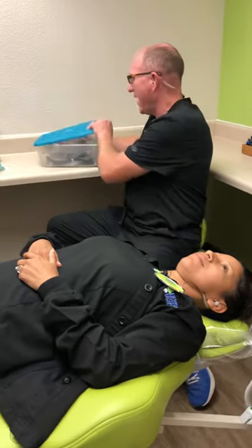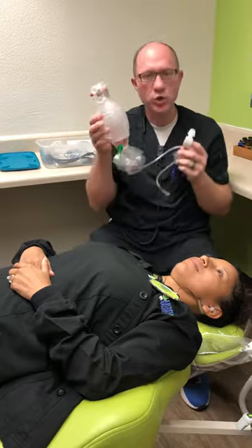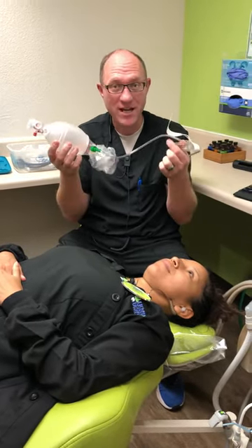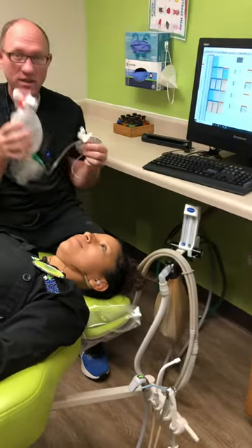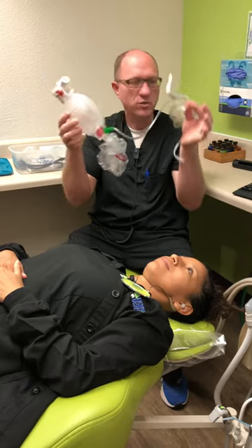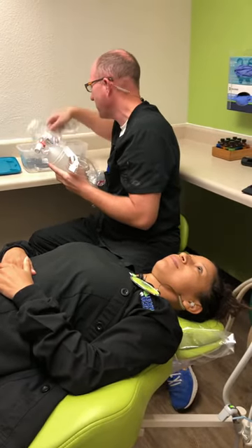Inside the Airway 1 bag, there is going to be what we call the Ambu bag — it's what looks like the big balloon. We have a couple different styles of them, and knowing how to attach this to the mask is really key so we can give the patient oxygen. There are two parts of the Ambu bag: there's the big section with the hose, the tube, and the balloon, and then there are a couple of mouth pieces and face pieces.